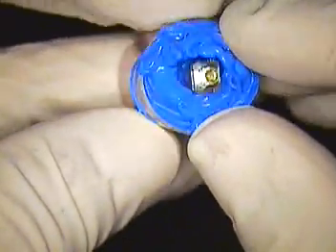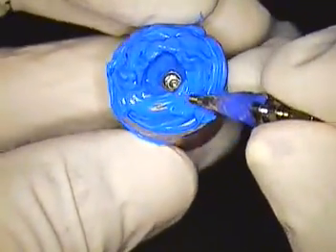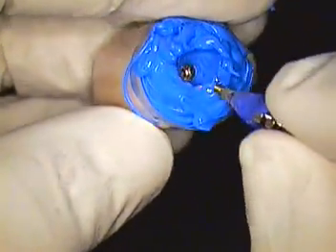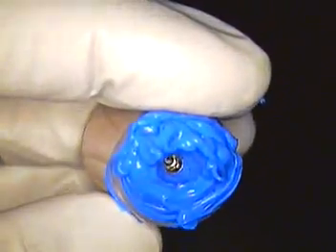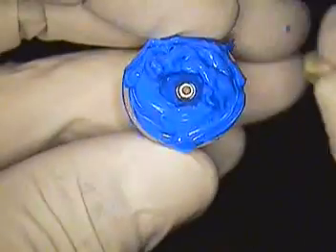So let's find out — the first thing you've got to do is make sure you've got the buccal and the lingual lined up properly, so that's important. This is the buccal aspect, that's the lingual — just double-check to make sure. And yes, indeed, that's what it is. So stay oriented.